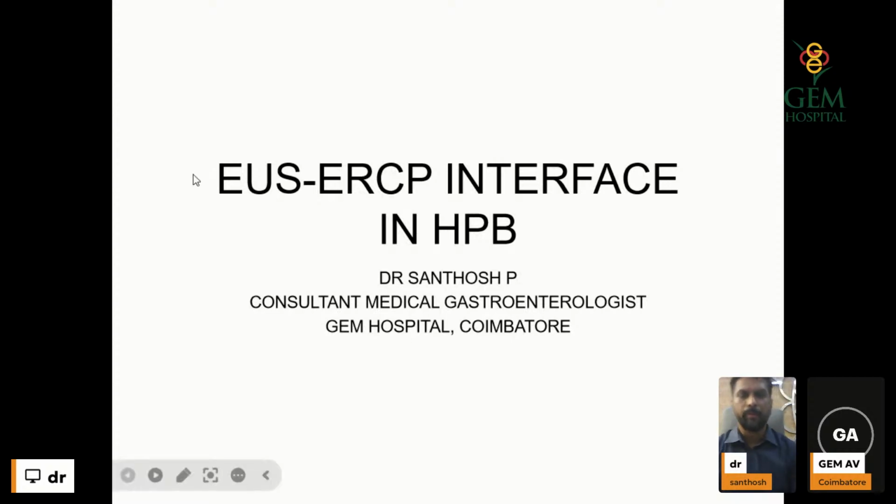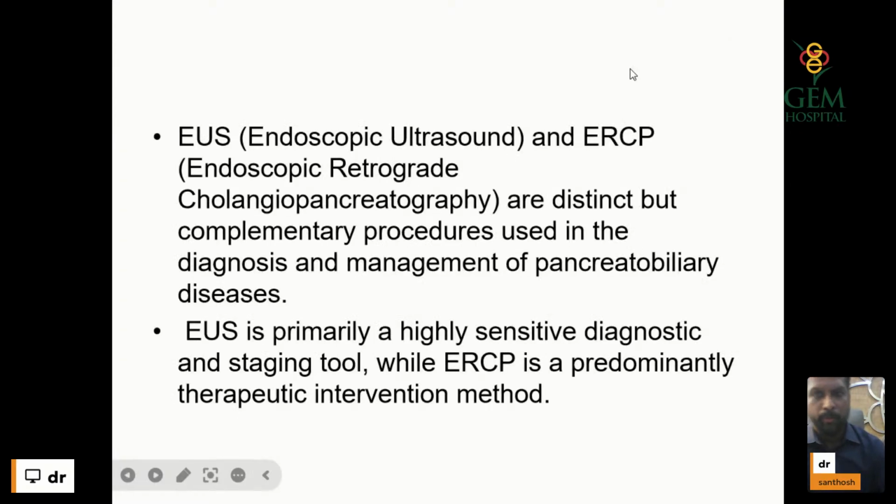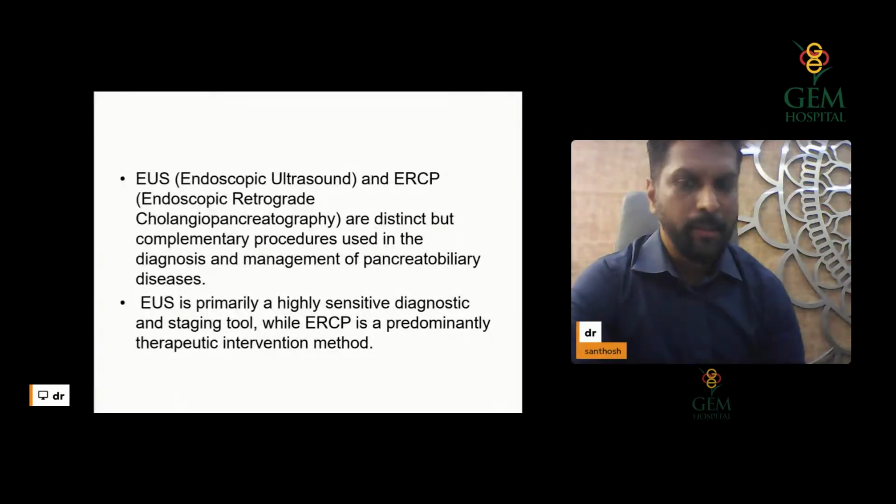So good afternoon, everyone. Welcome to Televersity. Today I'm talking about the EUS and ERCP interface in the hepatobiliary and pancreaticobiliary systems, coming to both modalities: EUS is endoscopic ultrasound, and ERCP is endoscopic retrograde cholangiopancreatography. They are both distinct, but they have a complementary role to each other. They are used in the diagnosis and management of pancreaticobiliary diseases.